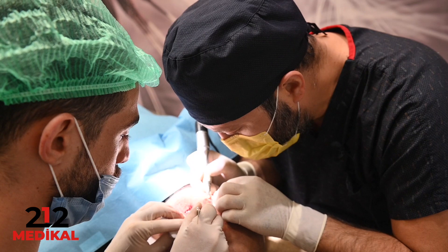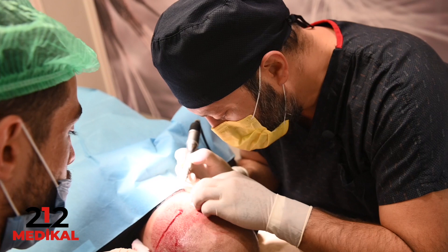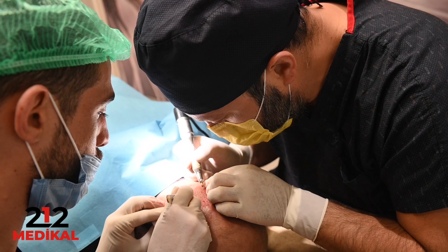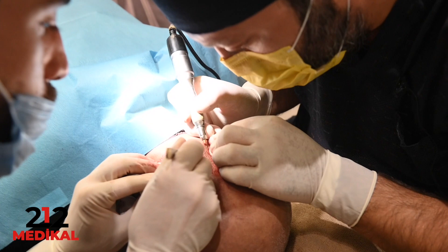There are three key points: sharpness of the punch, length of the punch, and diameter of the punch. An experienced surgeon knows that all patients are different, so they decide which sharpness, length, and diameter to use for each patient — and once that decision is made, the procedure becomes straightforward.